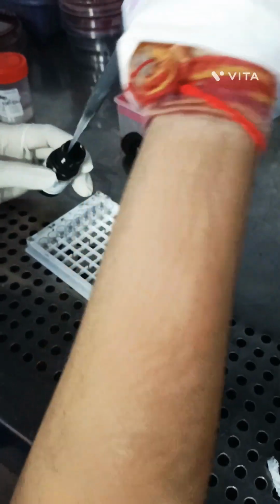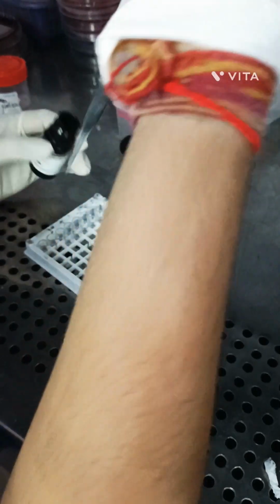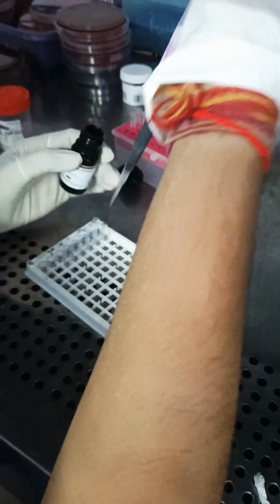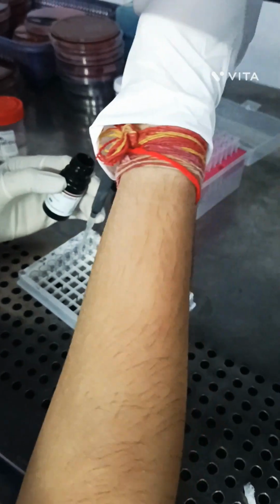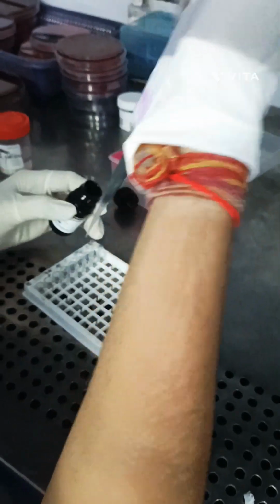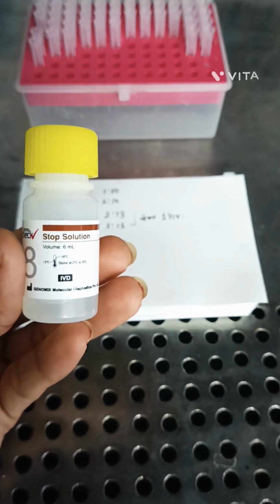It means if TB is present in the patient, blue color is formed. So if interferon gamma is positive in a standard well, it produces blue color.